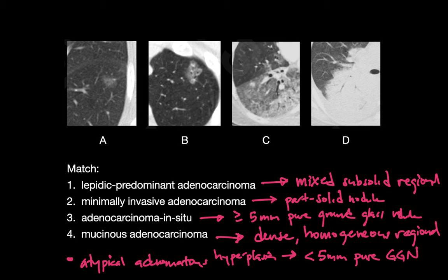In the four examples shown, the first nodule was an adenocarcinoma in situ, the second was a minimally invasive adenocarcinoma, the third case was lepidic predominant adenocarcinoma, and the fourth case was invasive mucinous adenocarcinoma. Historically, adenocarcinomas in situ, minimally invasive adenocarcinoma, lepidic predominant adenocarcinoma, and invasive mucinous adenocarcinomas used to be referred to in aggregate as bronchoalveolar carcinomas or BACs.